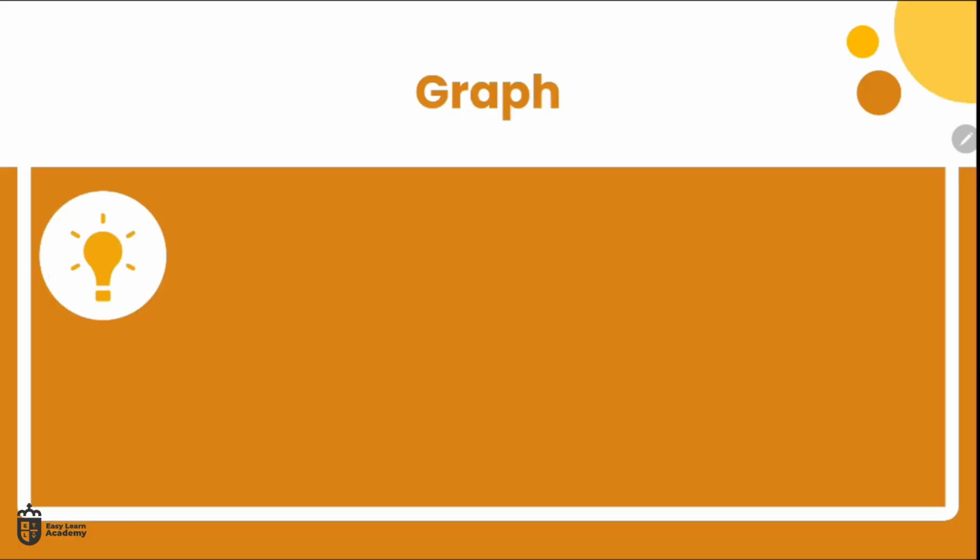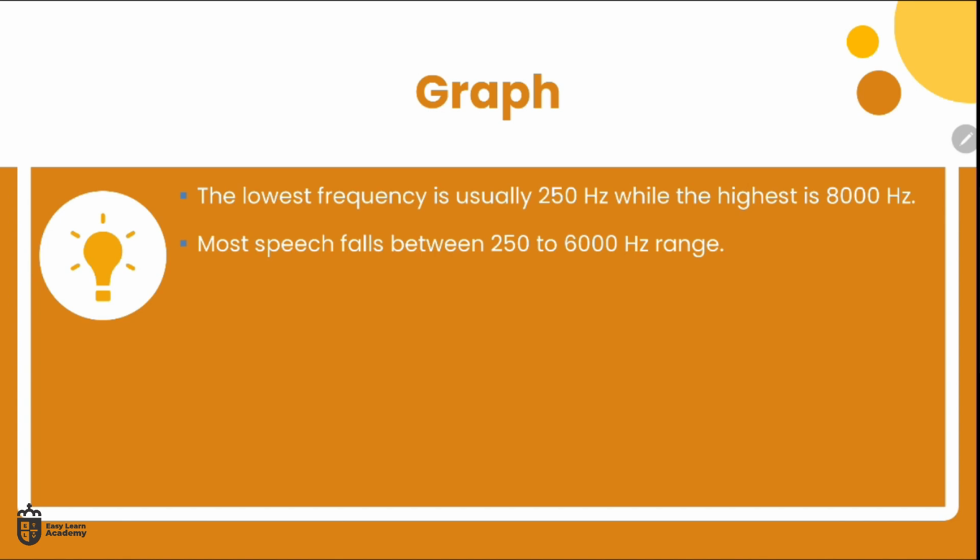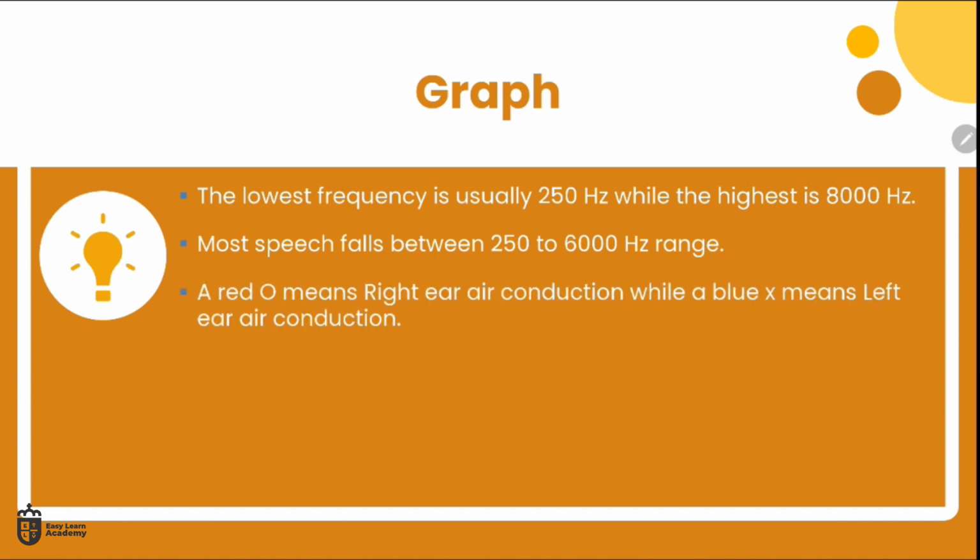Now, if you look at this carefully, these are just some points that you may like to know, the first two. We don't know what air and bone is, and that's what we're going to try and establish. When you see an O and X, I call it X and O, but depending on how you want to start, O and X is all about air.